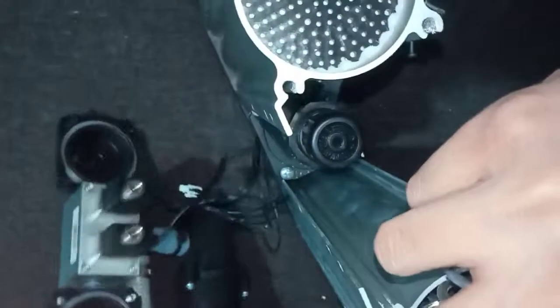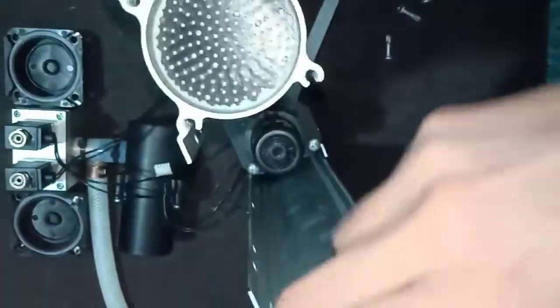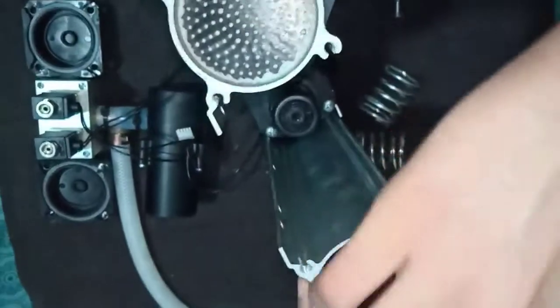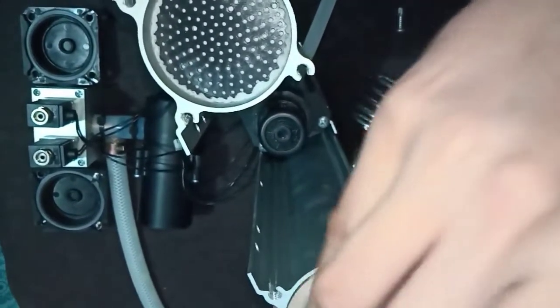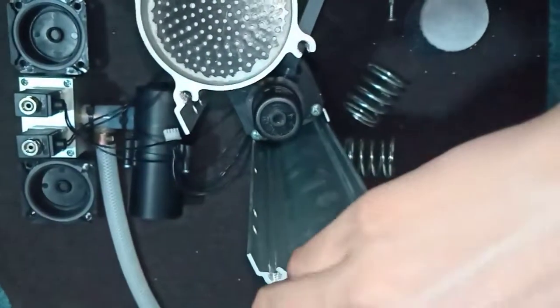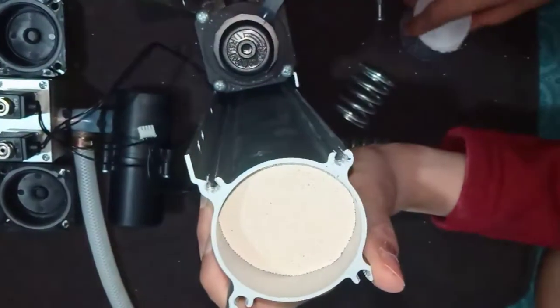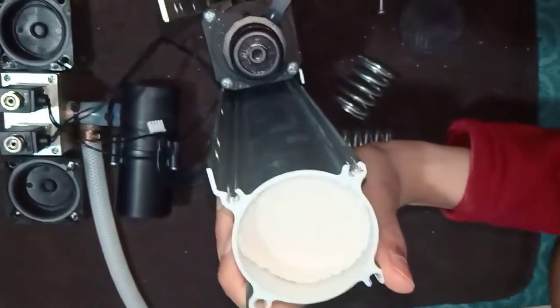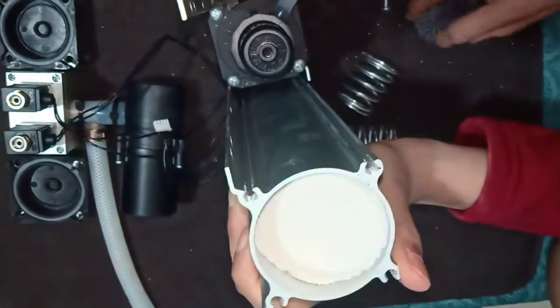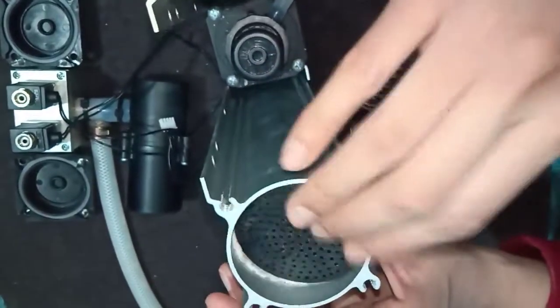I've unscrewed all the sections, and right here we have two springs to push the molecular sieve inside. Then we have a coating which tightly encloses the molecular sieves inside it. These are the small molecular sieves which absorb the nitrogen from the atmospheric air and give us oxygen back. That's pretty much what a molecular sieve bed comprises of.